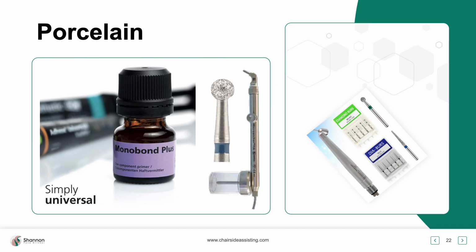And sometimes the patient will actually pull it off. So again, I want to make sure you know how to put it on, and we're not going to utilize the same bonding technique for porcelain as we do for enamel, right? We're going to acid etch the teeth. We're going to use our etchant for that. But here we're using Monobond Plus, and this is basically treating the porcelain so we can then use our adhesive and place that attachment on that area. But we've got to treat the porcelain. It's not the same as treating unetched enamel, right? You want to understand that.